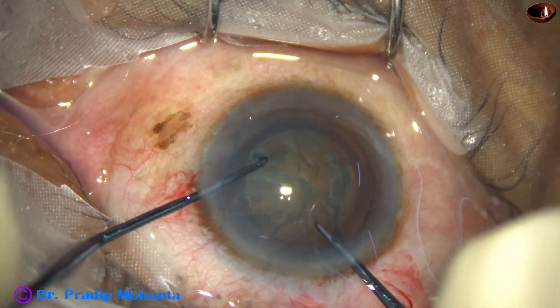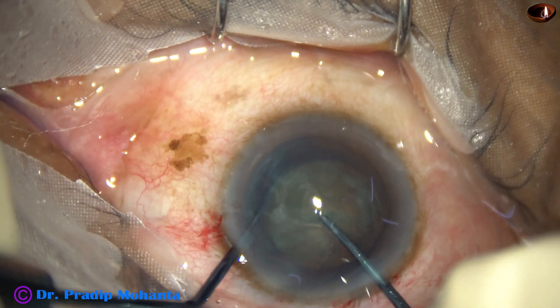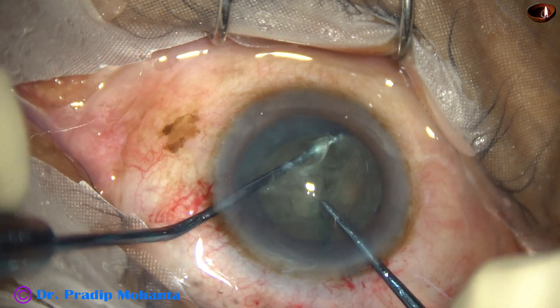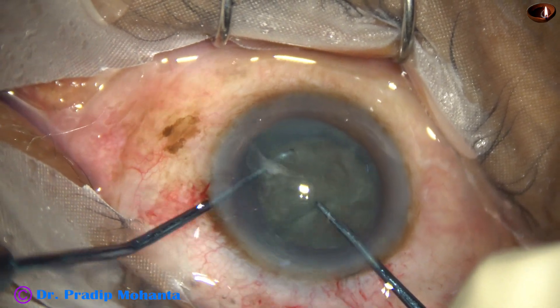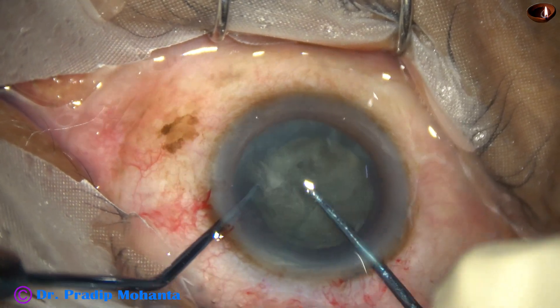The pre-chopper engages in the soft part of the nucleus just in front of the main wound. The sustainer hooks the opposite equator. The two instruments are brought to each other and lateral separation is done.